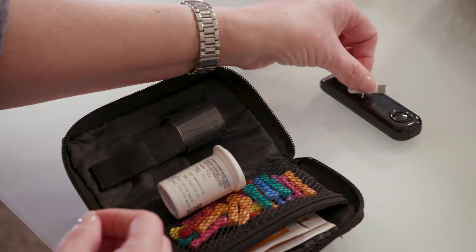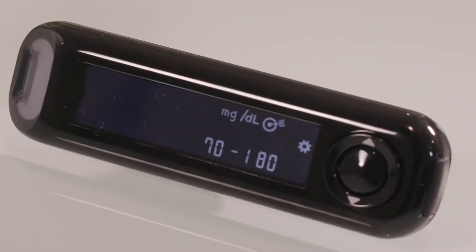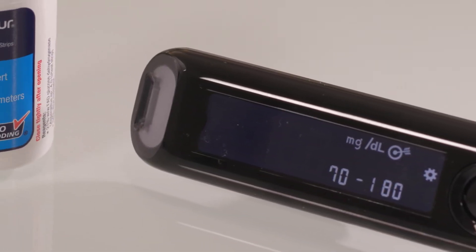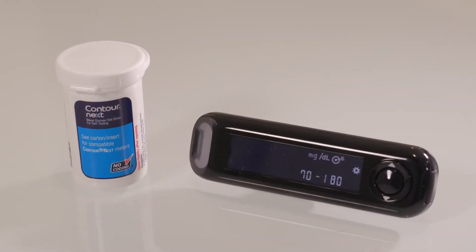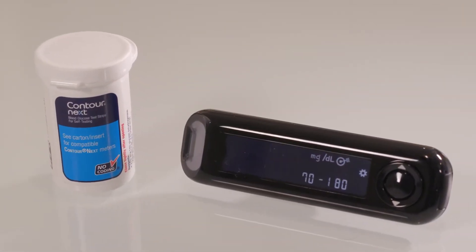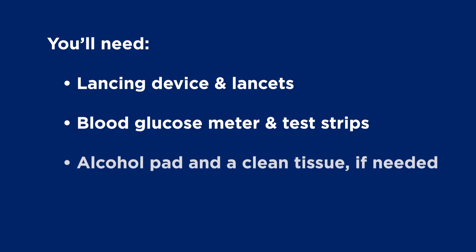Set the test strip on top of the meter until you're ready to put it in. We'll be using a Contour Next One meter and test strips. If you're using a different type, follow the instructions that came with it. If you don't have access to a sink to wash your hands, you'll need an alcohol pad and a clean tissue.